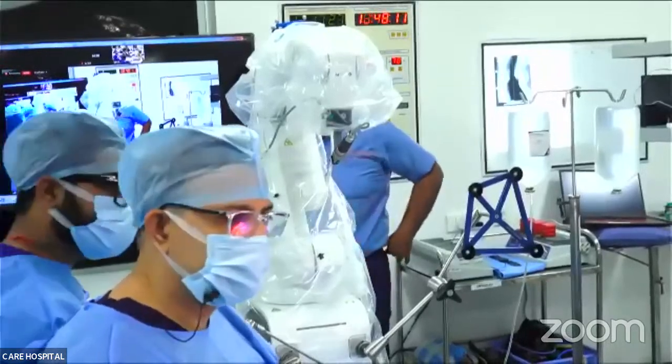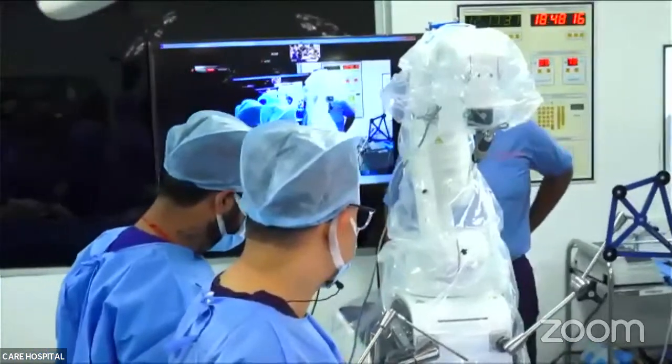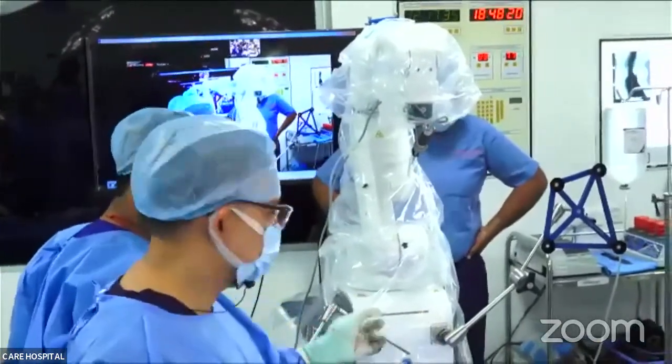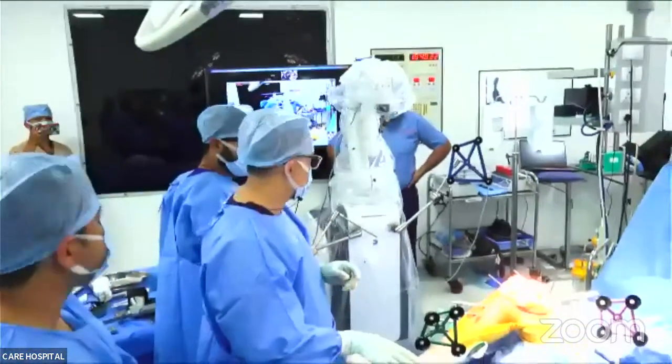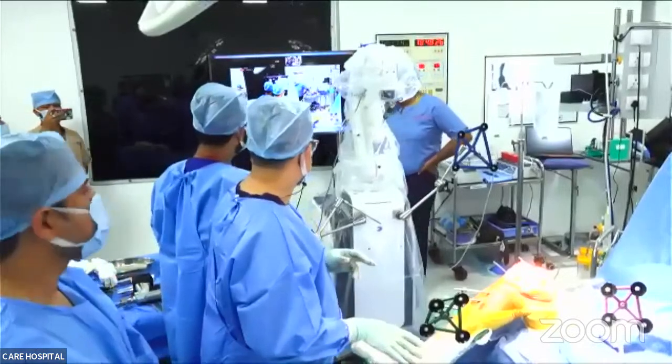Okay, now we'll bring the robot on the side of the surgeon normally. Opposite side is the OTS screen. The screen is opposite to the surgeon, and the robot is on the side of the surgeon.